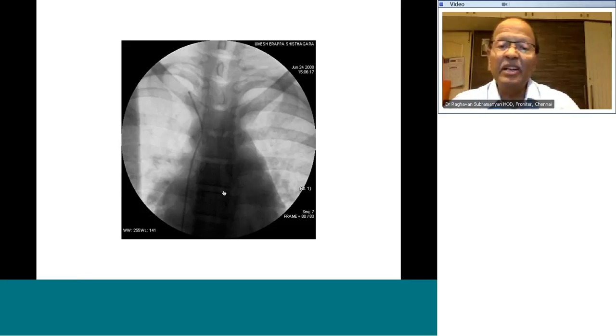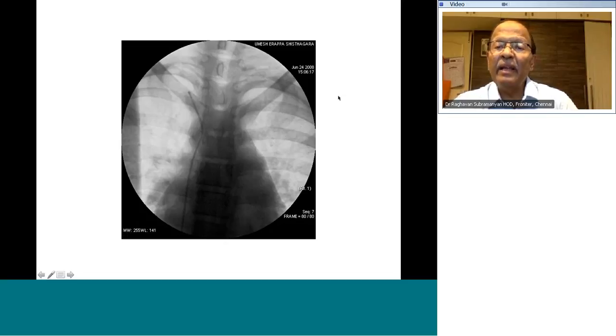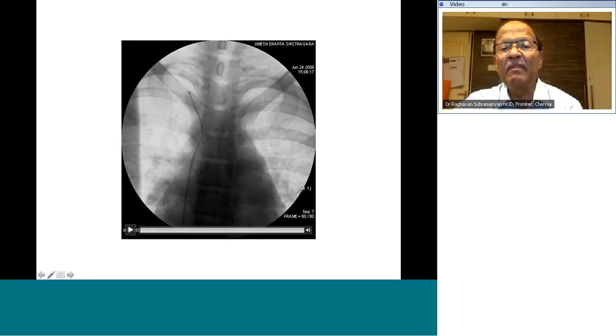Therefore, radiation is reduced. Secondly, you might get much better exposure. So, when you expose the X-ray over a large area, there would be some very dense areas and some translucent areas, and the camera gets confused, and the exposure may not be all right. It may come out as very white or very dark. Whereas the smaller the area you give to the automatic camera, it is able to find out the appropriate exposure and give appropriate contrast. Therefore, it's always collimated to the small area.